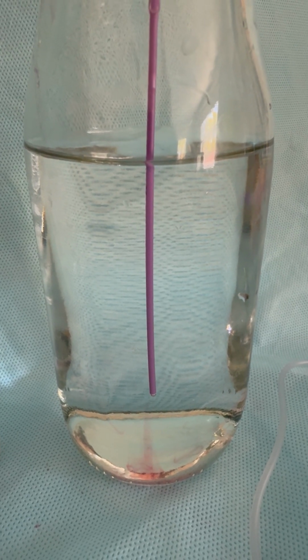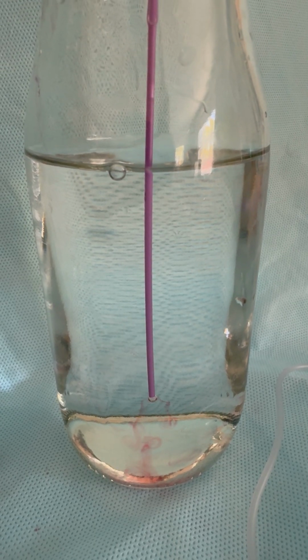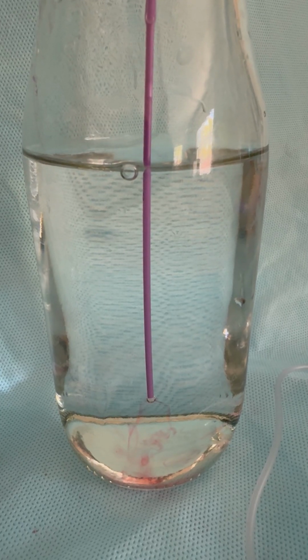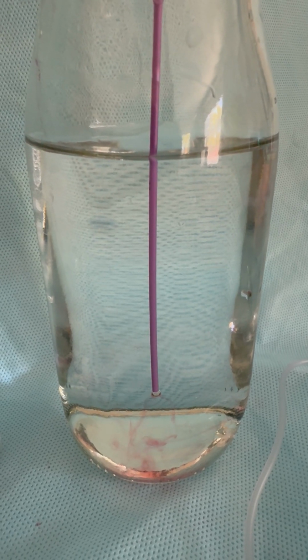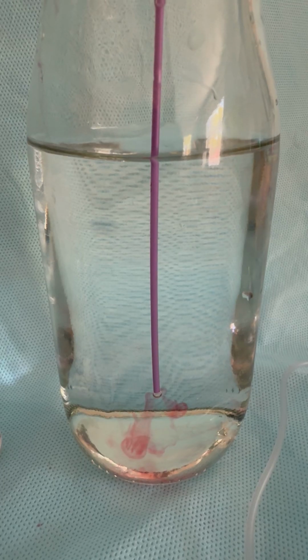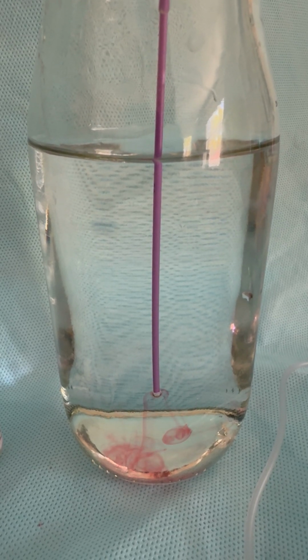So that's why, when I've told some of you, I like to give it a little at a time. If I'm going to give that whole milliliter or that 2.2, if you just throw it in there, it actually just goes into the vascular system. So if I give a little bit and I've broken down that clot, and then a few minutes later, 10 minutes later, 15 minutes later, I give a little bit more, I think it helps break down our clots better.